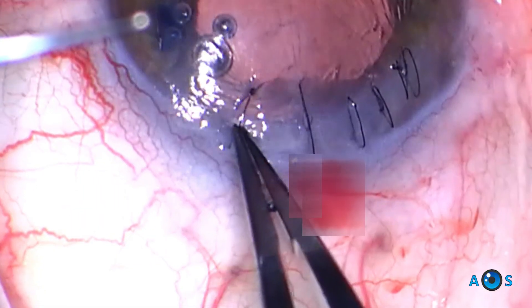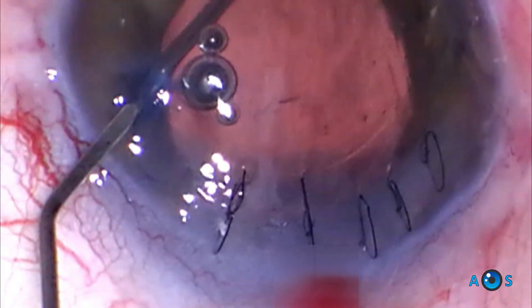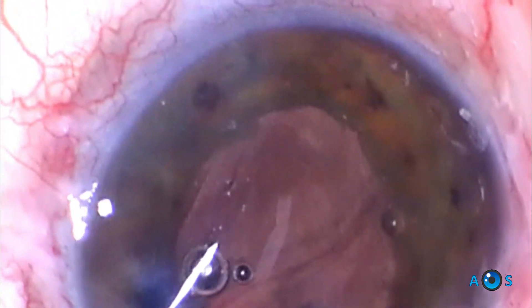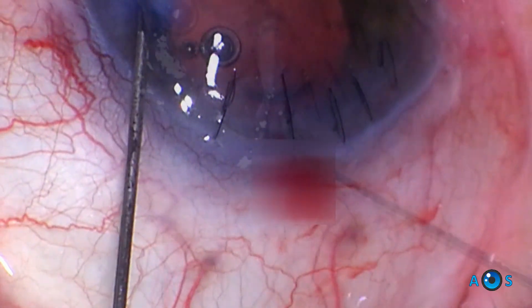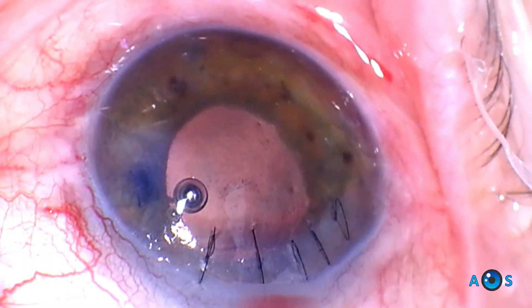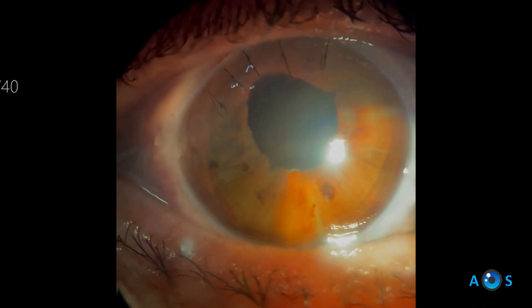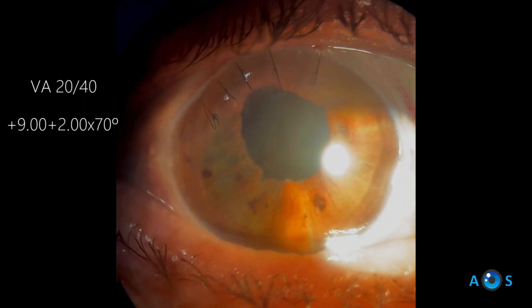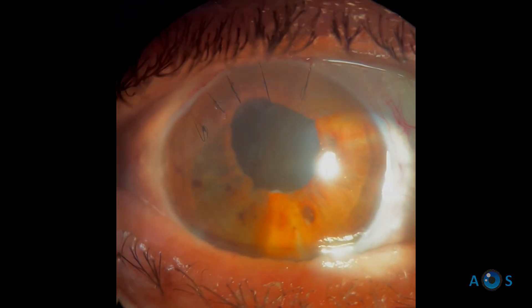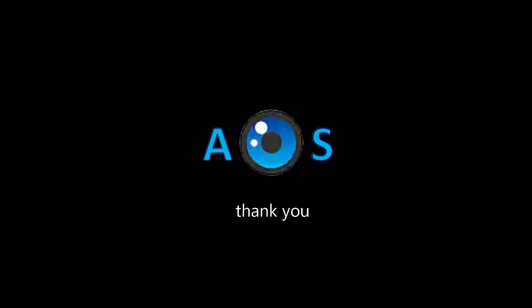The suture knots are rotated towards the stroma as we are ending this complex surgery. We opted not to place an IOL, as due to the density of the cataract, there was no way of knowing the macular or optic disc status. So we prefer to perform a careful post-op assessment and decide the most suitable secondary implantation technique. Remarkably, on the first post-op week there is no corneal edema at all, the pupil is centered with no major defects, and the patient – despite being aphakic – is already reporting seeing better. In a few weeks, the secondary IOL scleral fixation surgery will be scheduled.